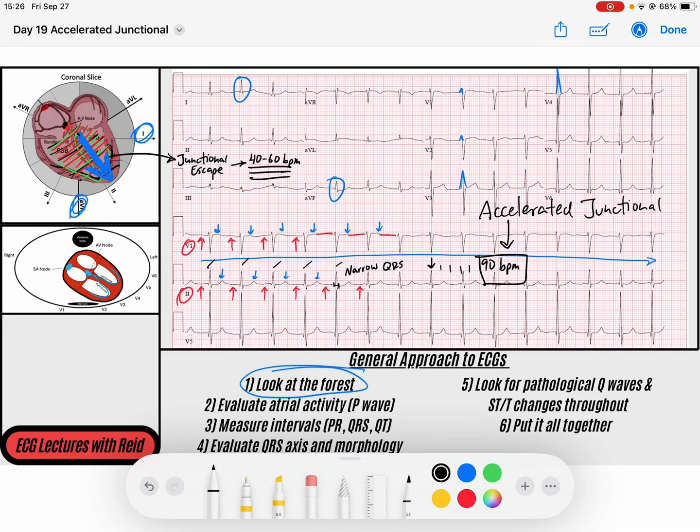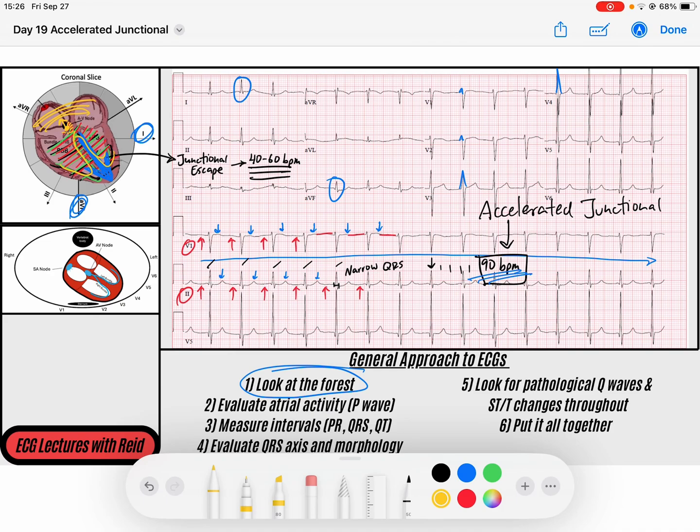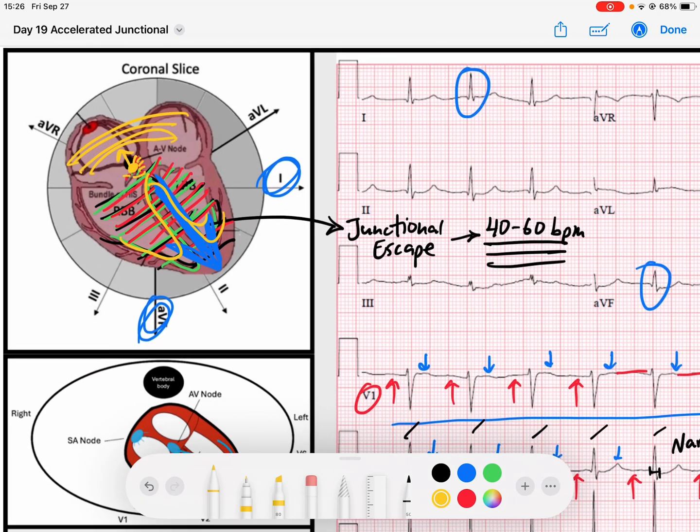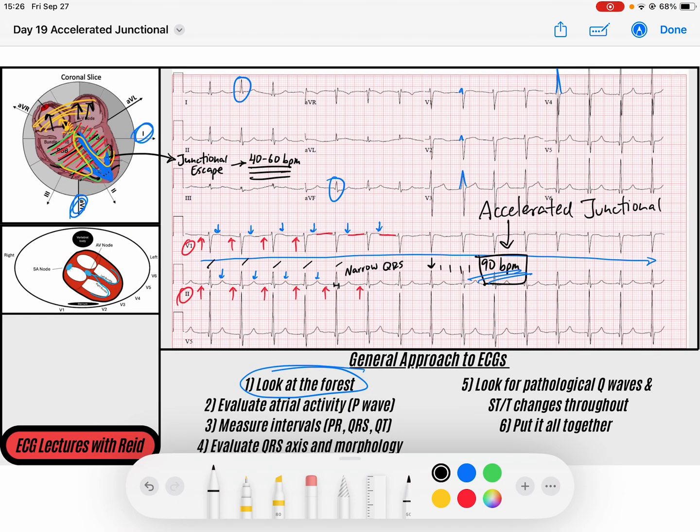This individual's junction is a bit hyperactive — there must be a focus somewhere within the AV junction creating a nice narrow complex rhythm, just occurring too fast at 90 beats per minute. You might be asking what's happening within the atria. Depending on the junctional focus, these foci can fire off and send signals down into the ventricles, but they can also send retrograde signals up into the atria and cause retrograde atrial depolarization. That's not always easy to detect because if it's happening simultaneously, those retrograde P waves aren't always noticeable. In this case, that might be what's happening.